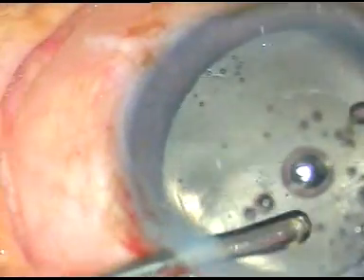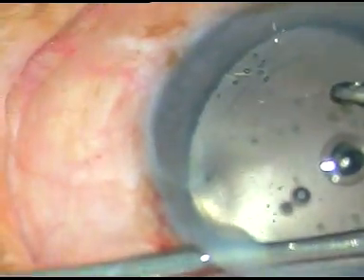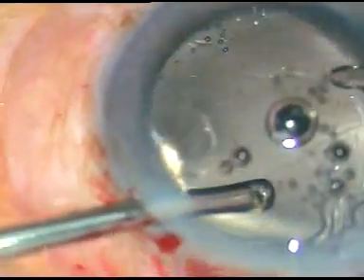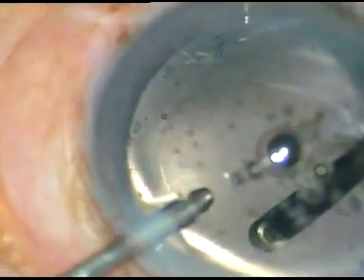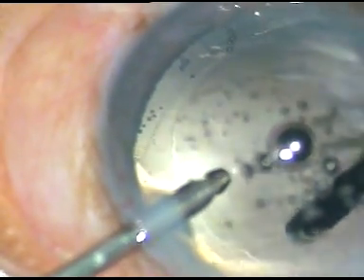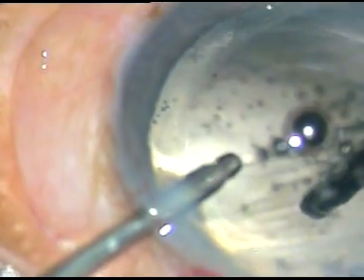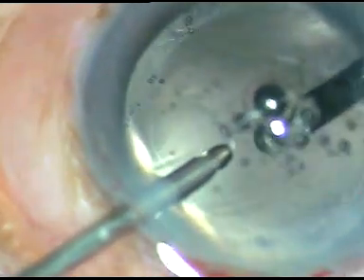However, I could detect the vitreous strands that were coming out through the incisions, and I could cut all those strands and clear the anterior chamber of vitreous strands. Now I can see the rhexis margin all around clearly.